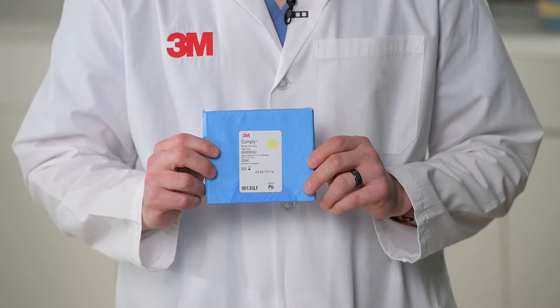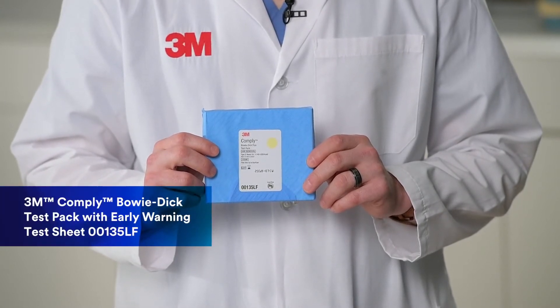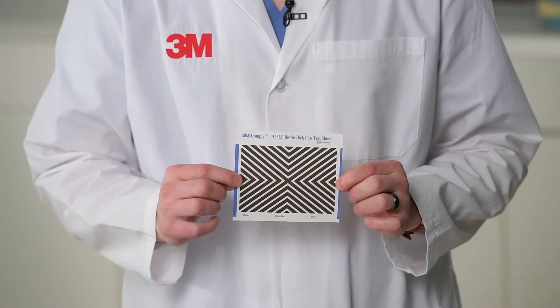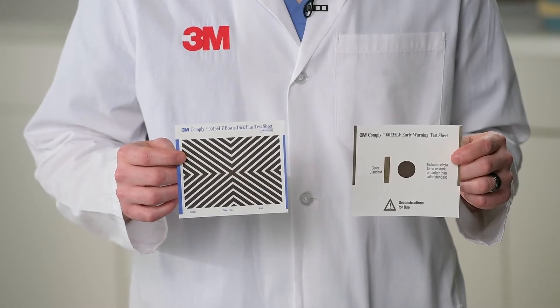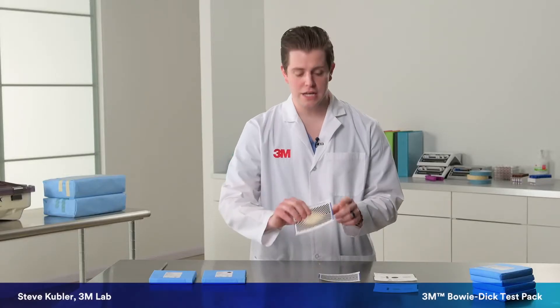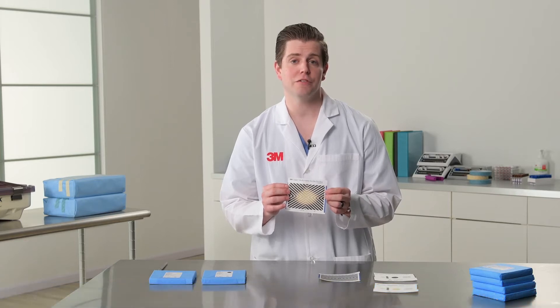There are two parts to the 3M Bowie-Dick Test 00135LF: the early warning test sheet and the test sheet itself. These sheets should both show a uniform color change. If you recognize a non-uniform color change, like the one in my hand, this would indicate a failure.